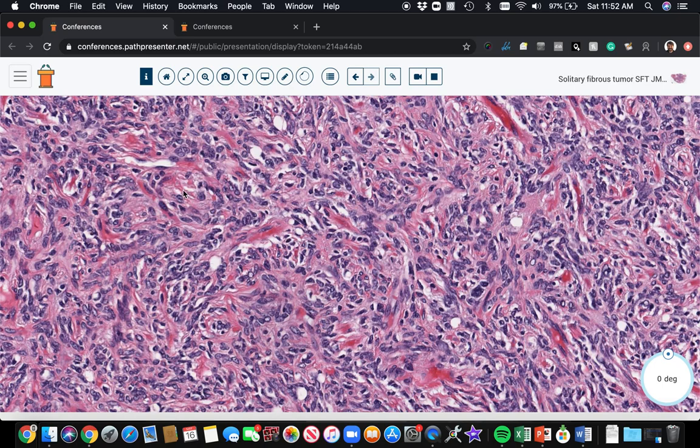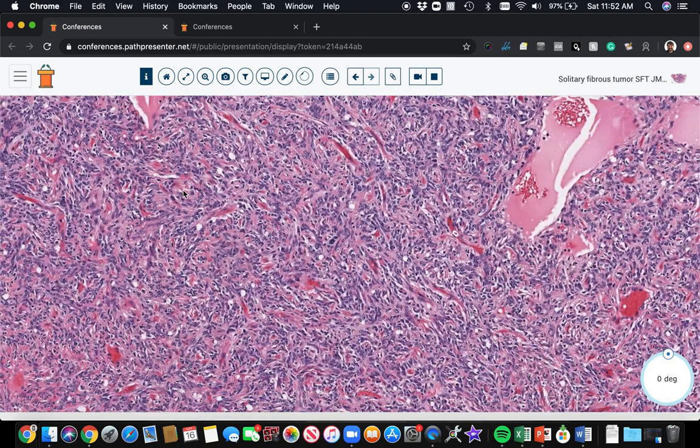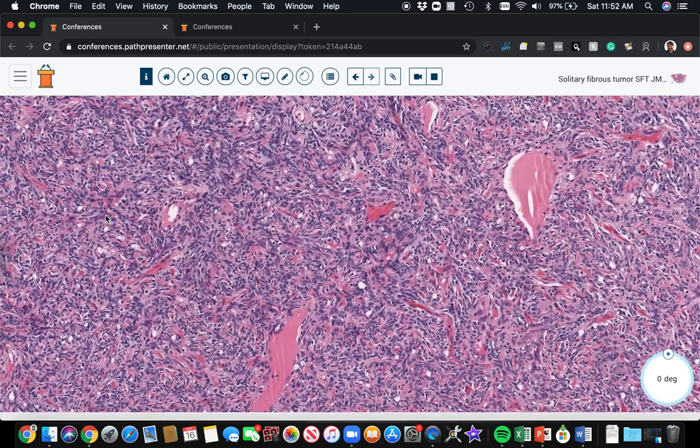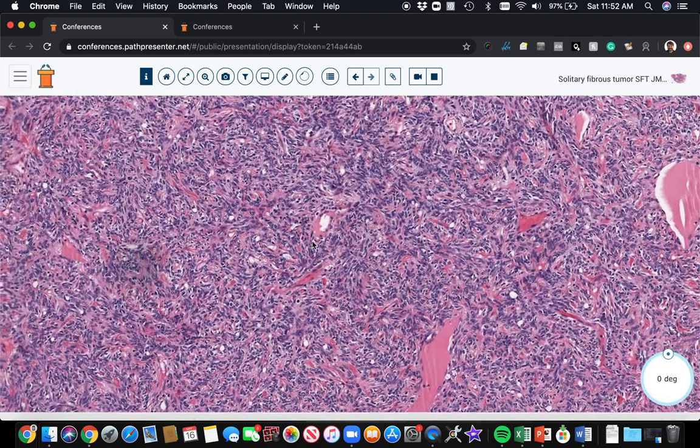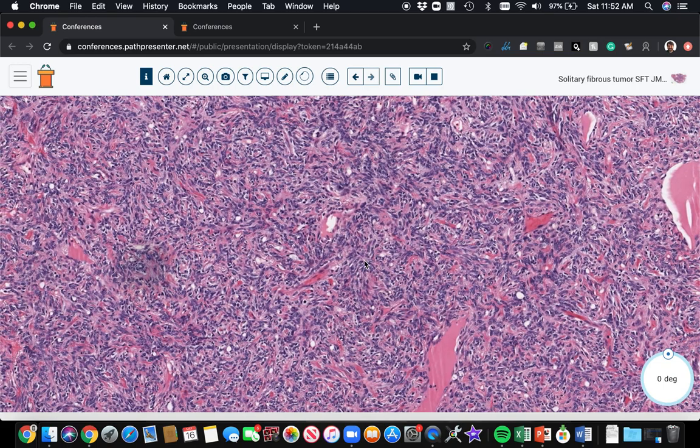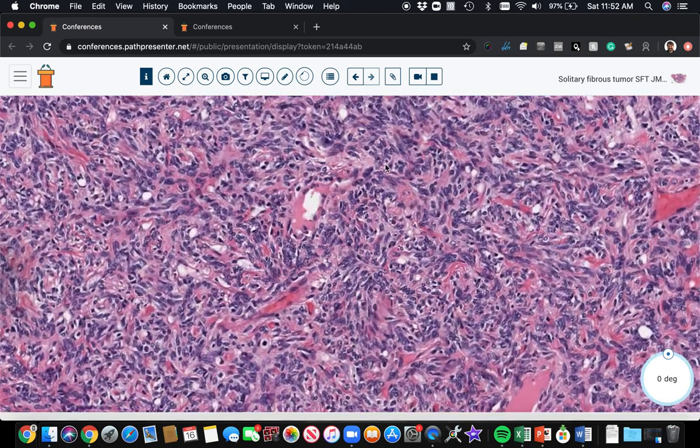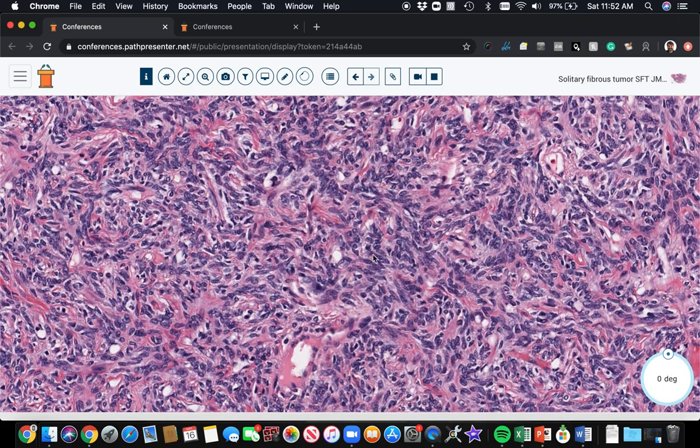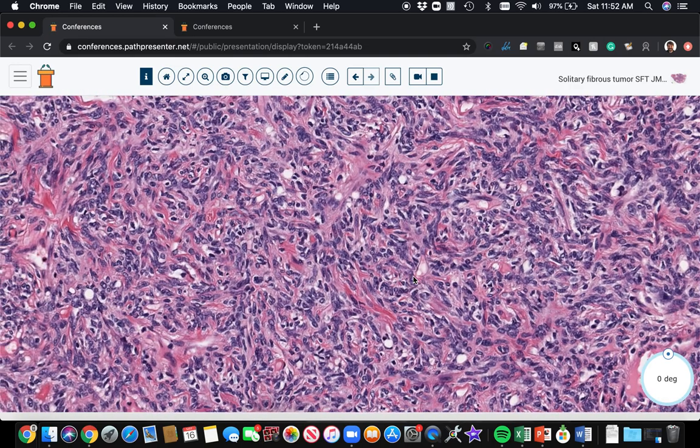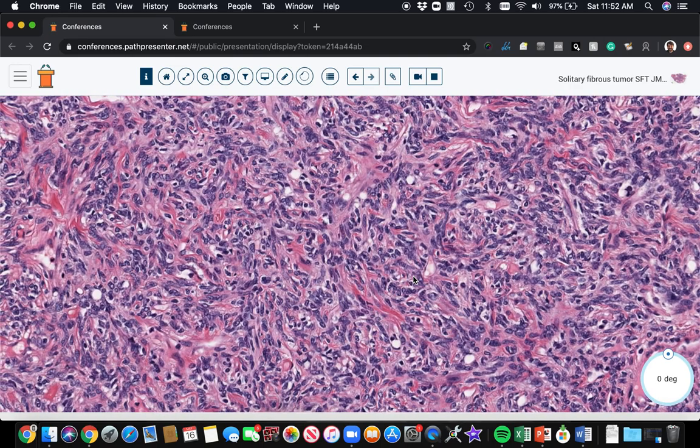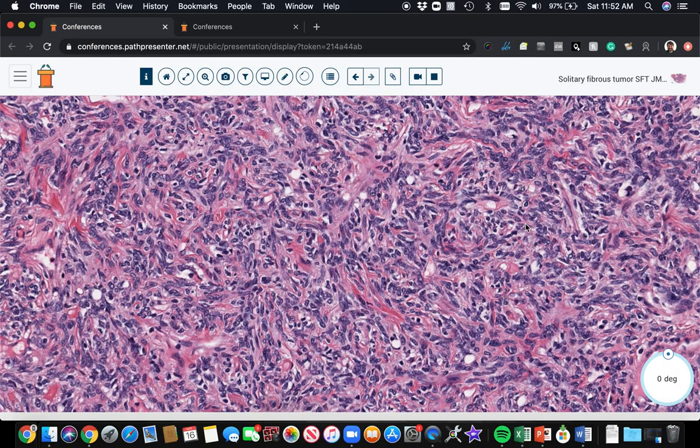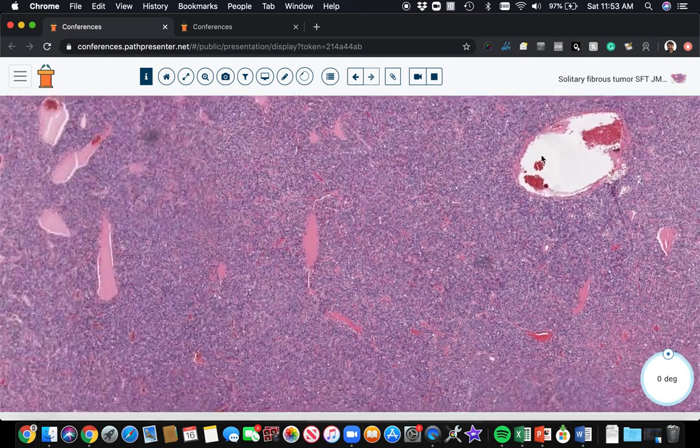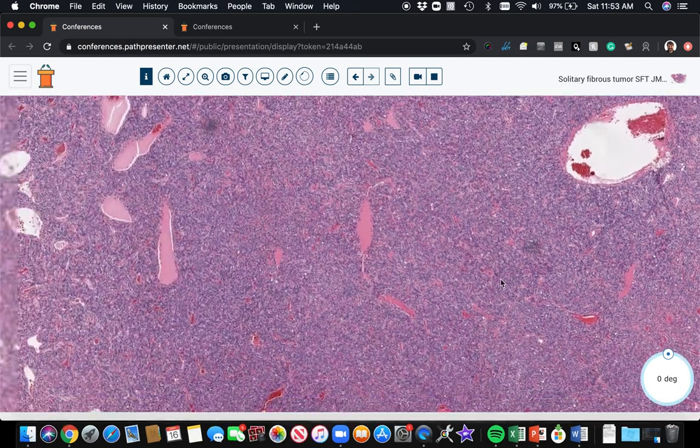Sometimes you can see them in kind of short fascicles or areas that look almost like a storiform or a bit palisaded. See like here, these cells are kind of lining up. So sometimes there is a little pattern, but usually they're kind of just kind of thrown together and swirling around here, randomly with the collagen and the dilated vessels.